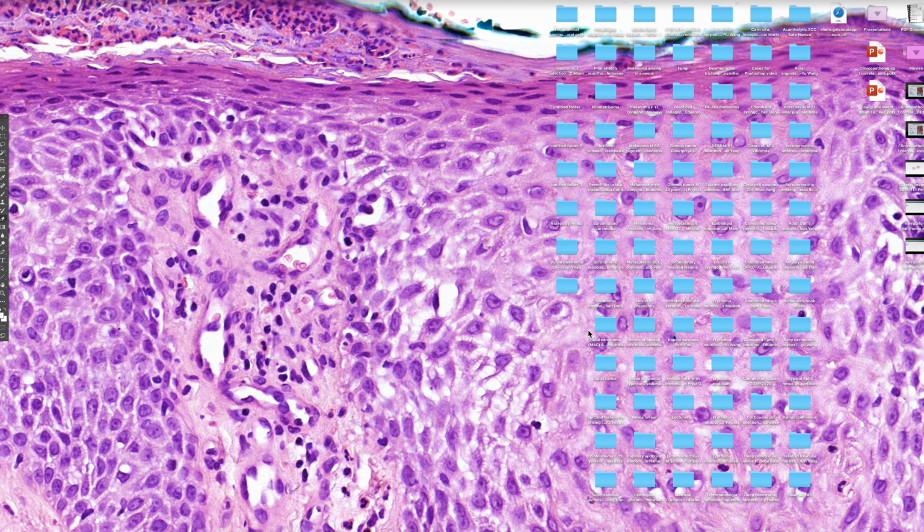I've got to find where this is now. The trouble is I put this pretty histology on the desktop and now I can't see anything, so that'll teach me. Oh, it's Untitled 3.